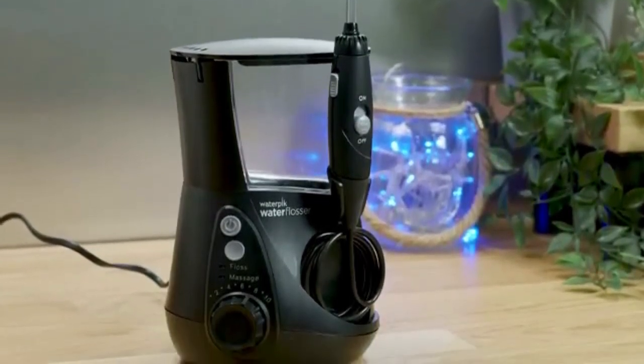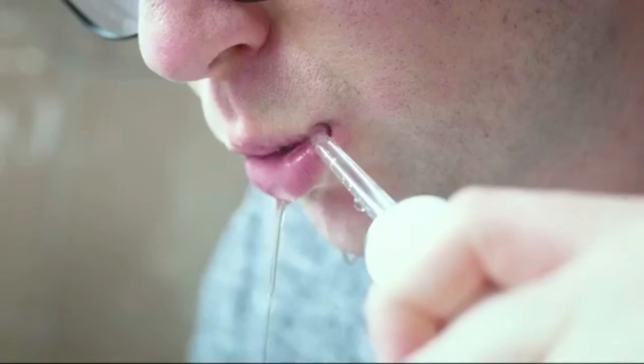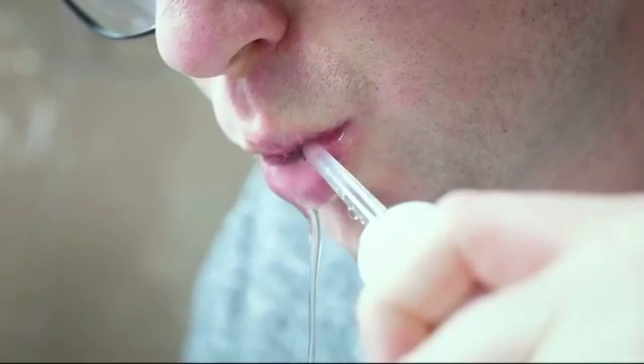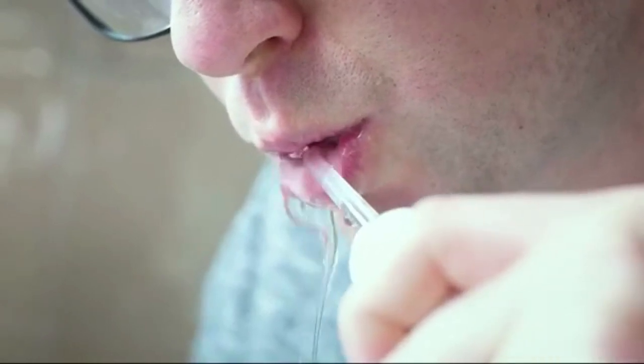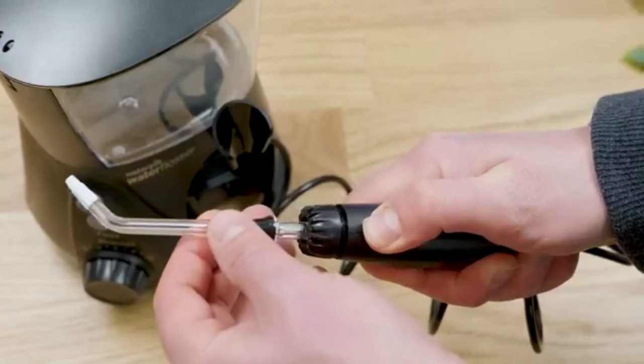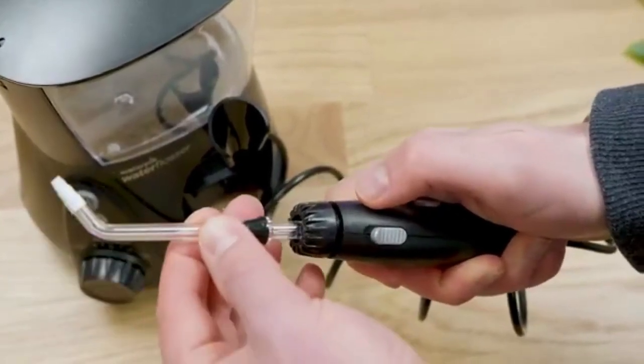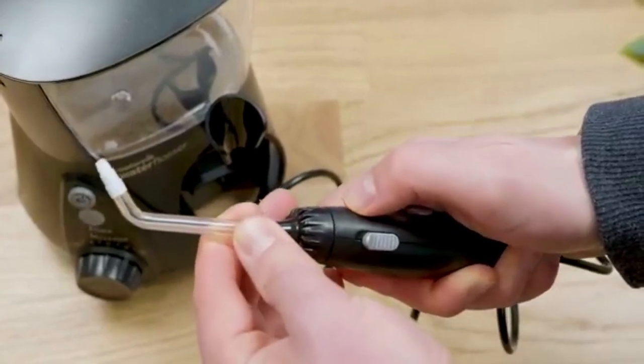So whether you have all your own teeth with no issues, you are wearing fixed braces, you have a full set of dental implants, a few crowns, or maybe you have been diagnosed with advanced gum disease and have periodontal pockets — the Aquarius has you covered. In fact, you get no less than seven tips included in the box, designed to suit the most common user needs. You are going to get the best results if you use the one best suited to your personal circumstances.